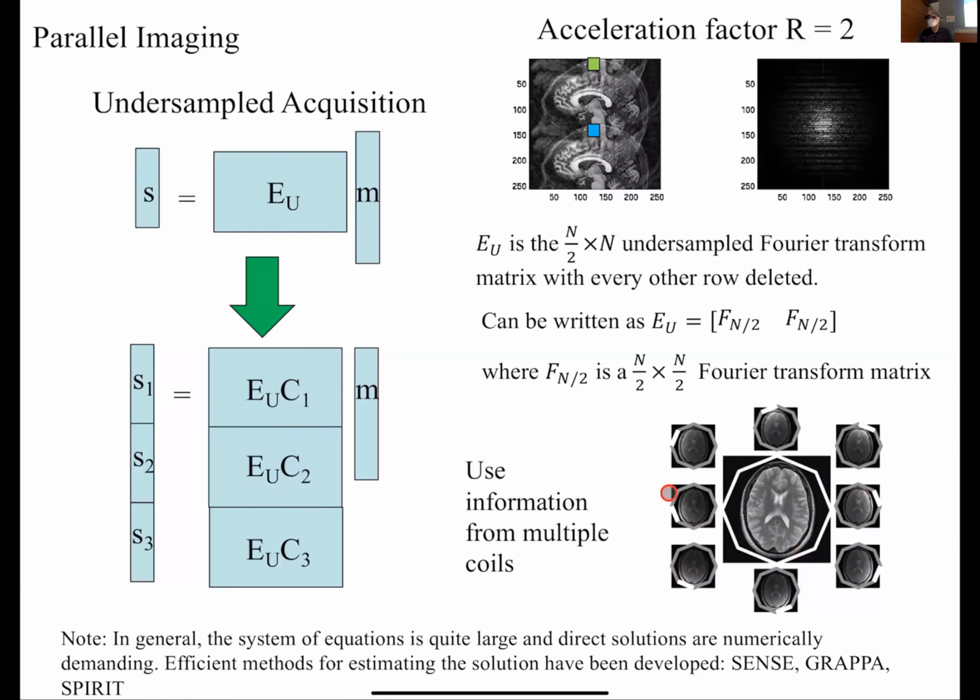It turns out that for the solution, these matrices can be pretty big, okay? In your homework, they're relatively small matrices. But even with MATLAB, you'll notice it sometimes takes like 10 seconds, which is long these days, right? You have to wait 10 seconds for something, MATLAB's really thinking. If it was a really big matrix, it would just take a long time, and unless you had a GPU or something, it may take too long for your clinical system. Ideally, when you scan someone, you want the images right away so you can look at them. You don't want to wait an hour or something.